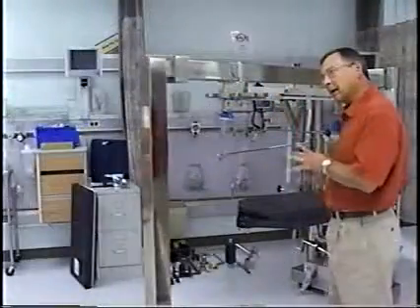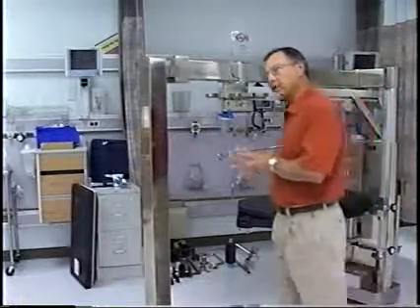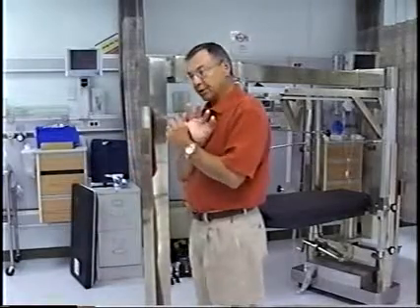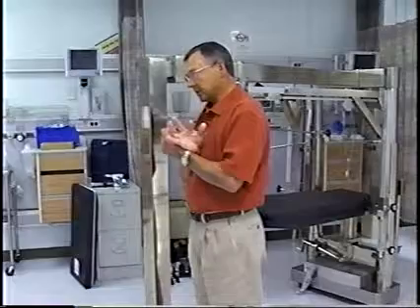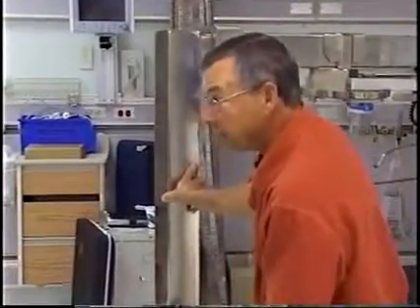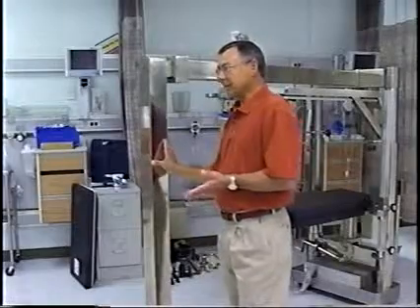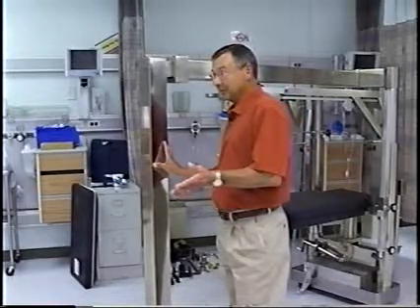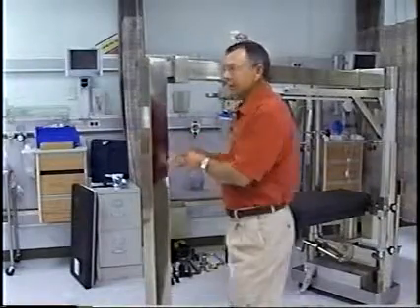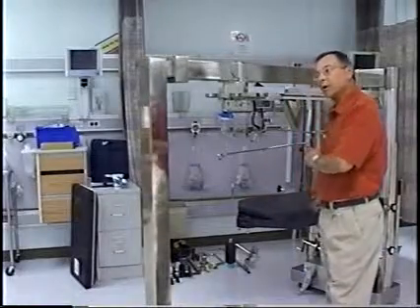But again, anything you do on a fracture table, whether it's ours or anybody else's, 90% of what you're going to be doing is supine hip compressions, or repairing of a hip. The unfortunate thing about orthopedics is it's always trauma. Whether it's a hip repair, a femoral rodding, or a tibial repair, it's always trauma. And unfortunately, they usually occur at 2 o'clock in the morning on a snowy night. So you all need to know how to set this table up for the majority of those things.